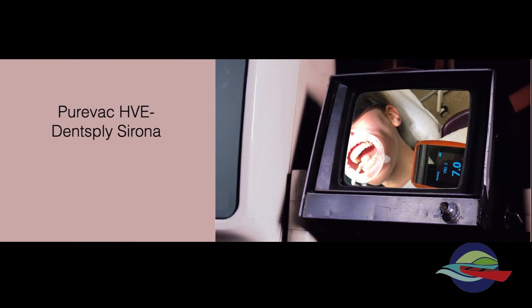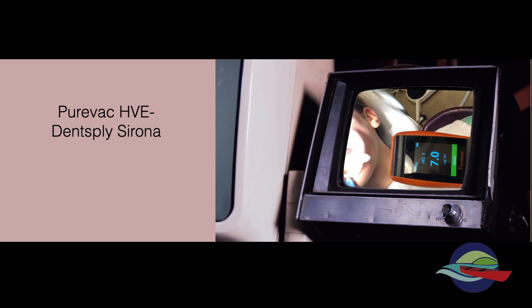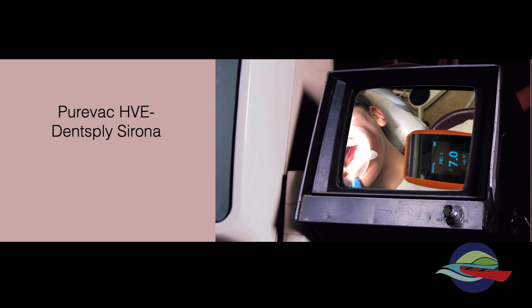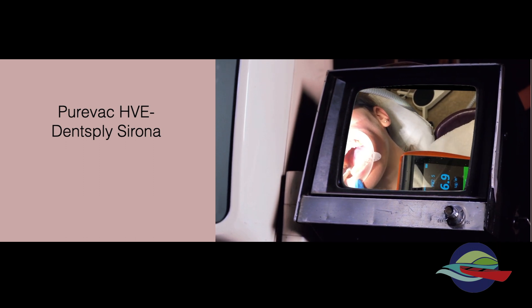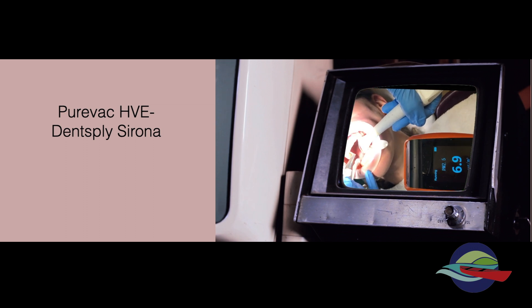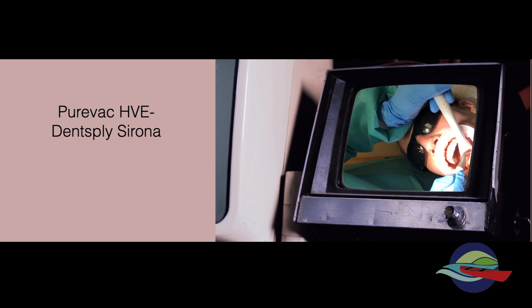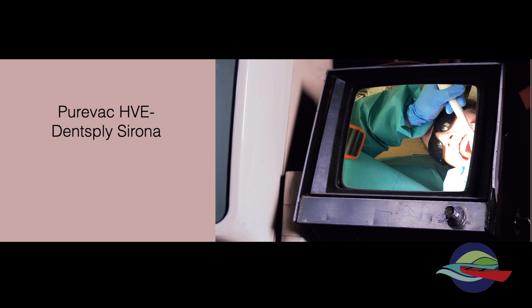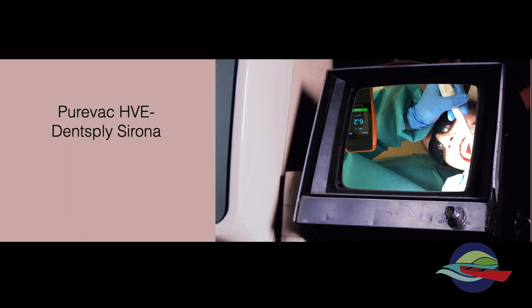The next unit we used was the PureVac system from DentsplySirona, and we used it in combination with an OpterGate to keep the lips out of the way, as we would do for GBT. This allowed excellent aerosol containment, and the clinician had much better visibility of the whole mouth. It was more efficient, as you didn't need to readjust the position to treat the opposite side of the mouth either. It was also quite light to hold the mirror, which was a benefit.